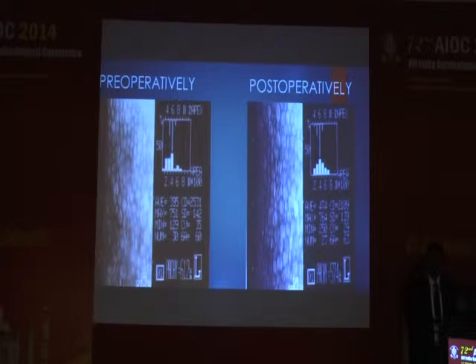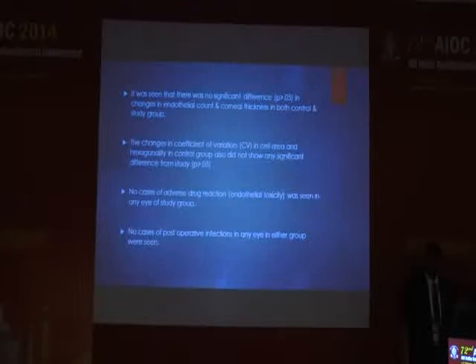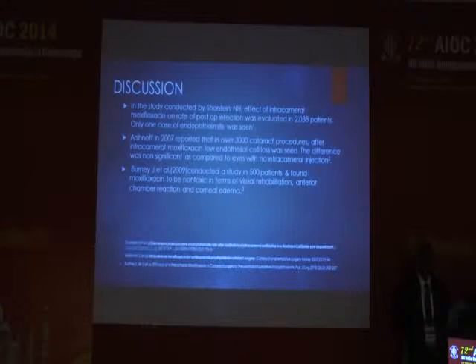This is the photograph of specular microscopy of a male patient of the moxifloxacin group preoperatively and postoperatively. No cases of adverse drug reaction were seen in any eye of the study group, and no cases of postoperative infection were seen in any eye in either group.